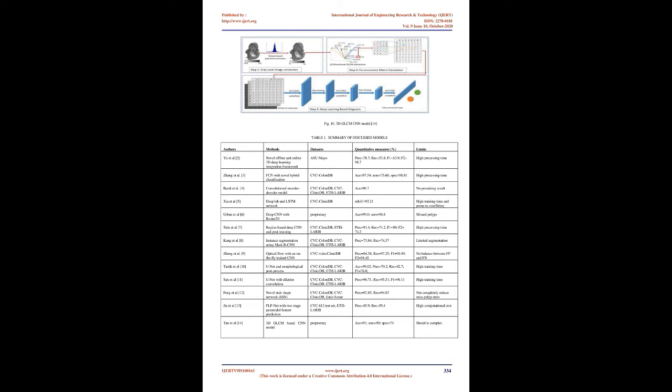The architecture of the model is an end-to-end convolutional neural network which includes a contracting part on the left and an expansive part on the right. The model takes a single colonoscopy image as the input and outputs a binary mask segmentation of polyps that has the same size as the input image on the last layer. To improve display effectiveness during colonoscopy, several post-processing operations are applied, such as smoothing, dropping small objects, and combining nearby objects. Feng et al. 12 developed a stair-shaped network, SSN, for real-time polyp segmentation in colonoscopy images.